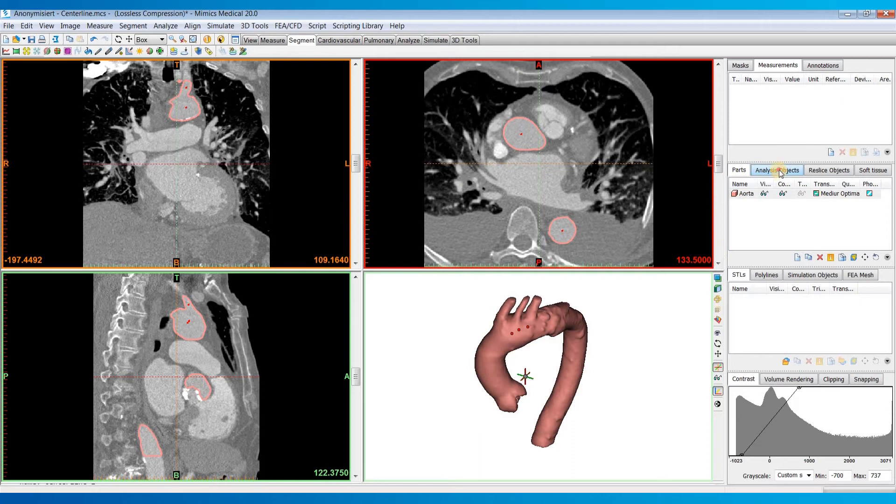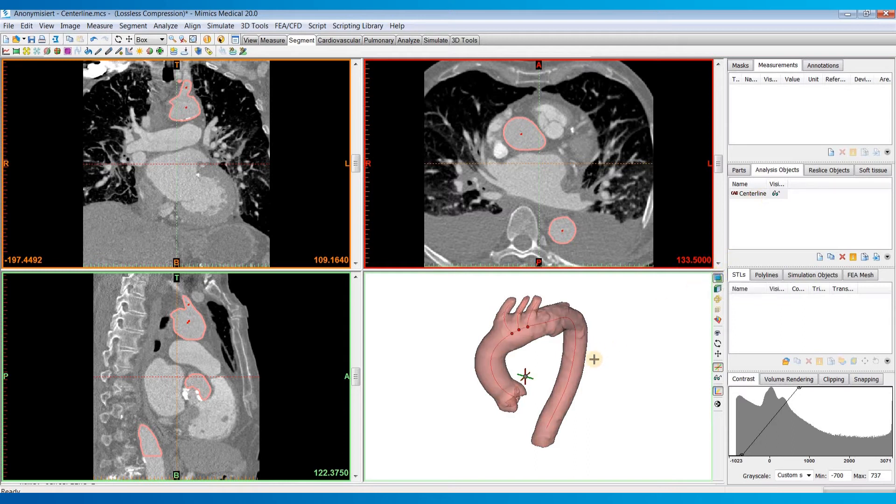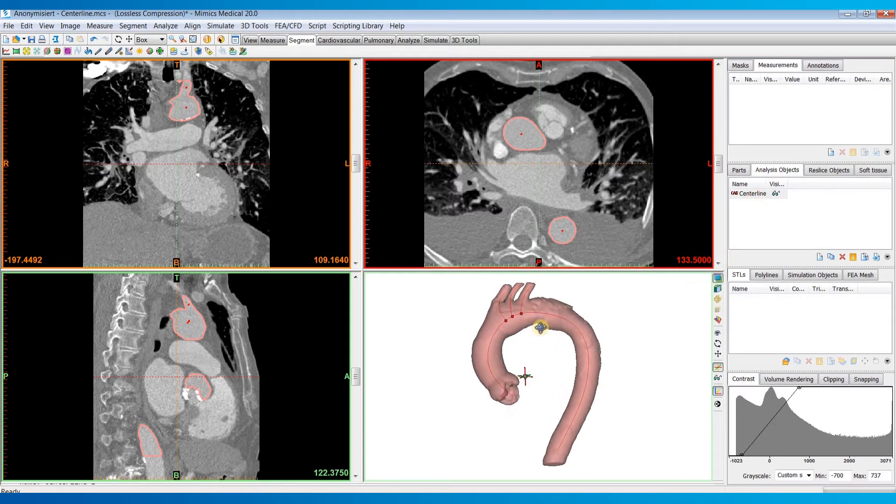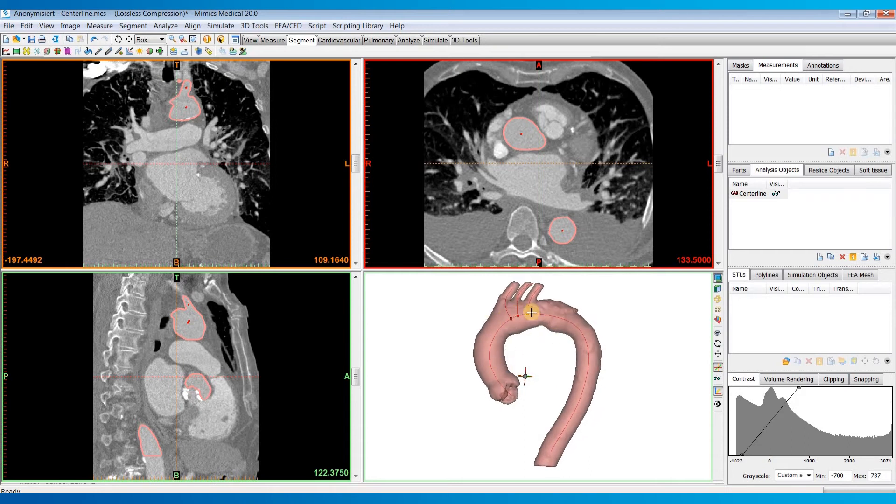And so under your analysis objects, you will see that centerline up here. And to visualize it, you can toggle the transparency of your part by clicking here. And we can now see that red centerline that was calculated.